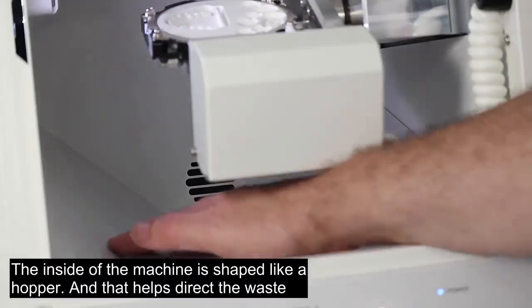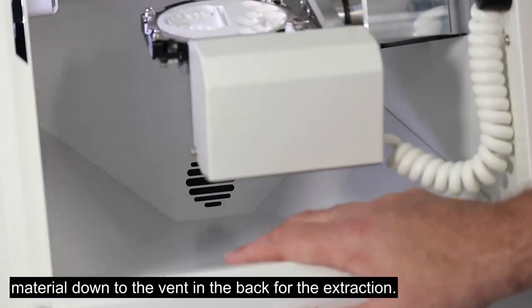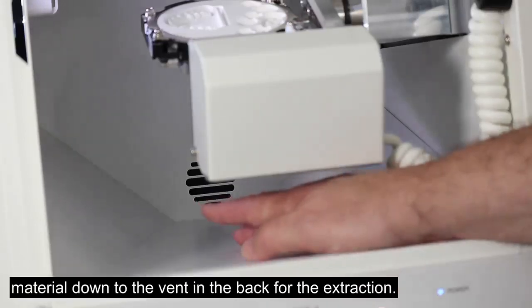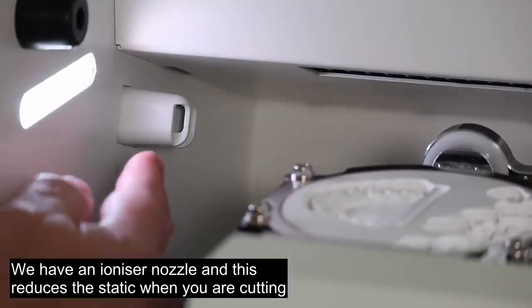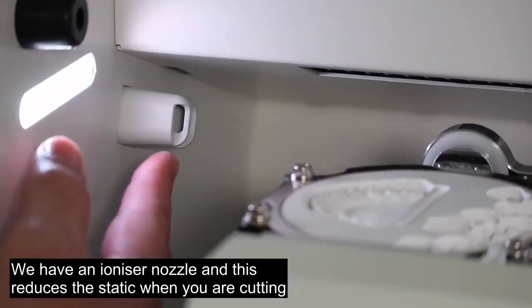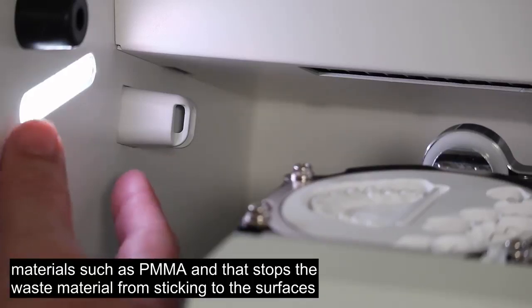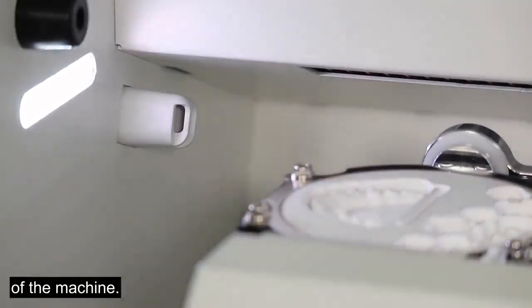The inside of the machine is shaped like a hopper, and that helps direct the waste material down to the vent at the back for extraction. We have an ionizing nozzle, and this reduces the static when you're cutting material such as PMMA, stopping the waste material from sticking to the surfaces of the machine.